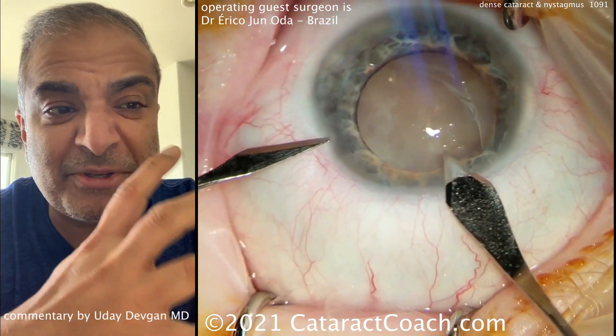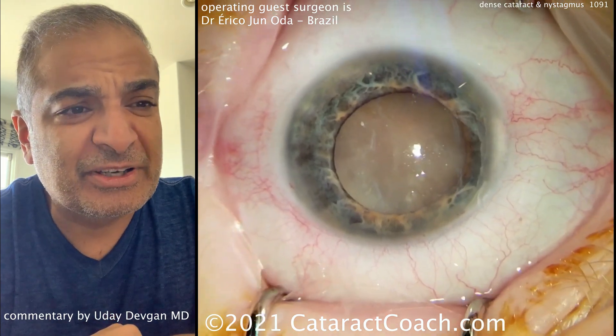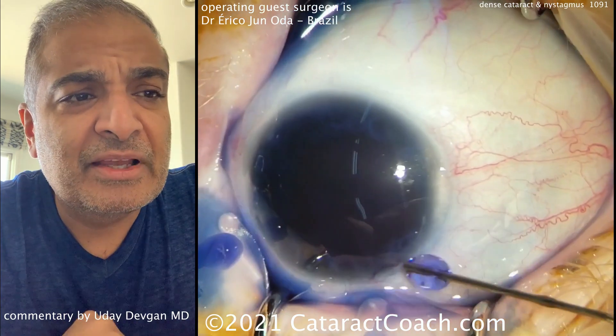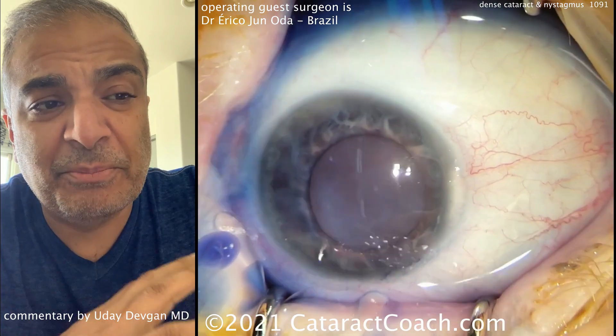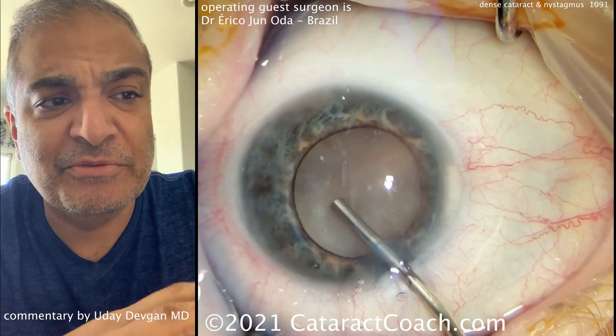That's a dense cataract. We've sped up the surgical video about two times the normal speed to get through the whole thing. Good looking incisions there. Now going into the capsule with TriPan Blue dye. For anesthesia, you probably want to do, if you can, a retrobulbar block — it'll make life a lot easier and really help minimize some of those eye movements.